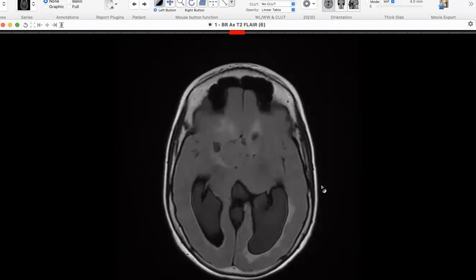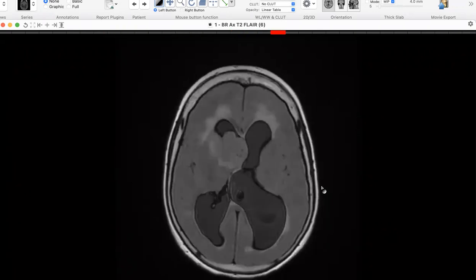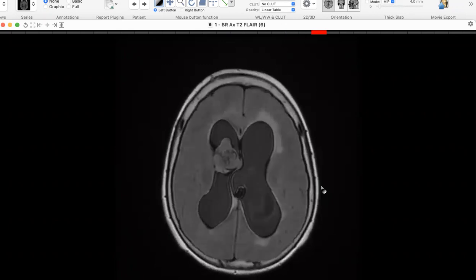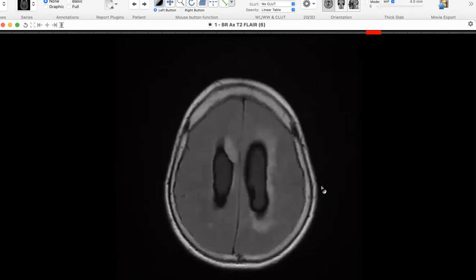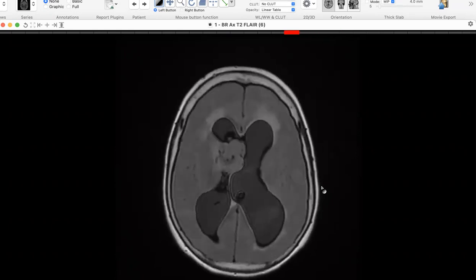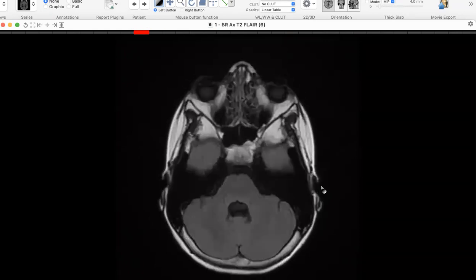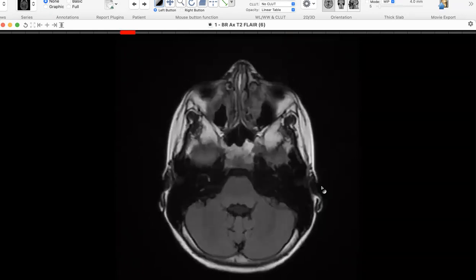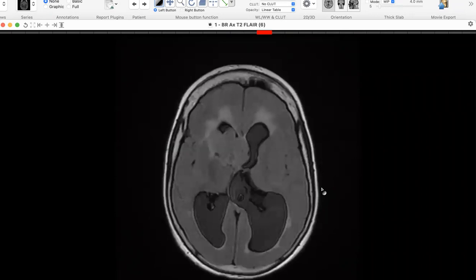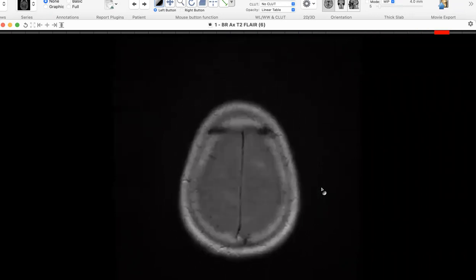Can SEGA be seen without tuberous sclerosis? Actually, it develops as an overgrowth of one of the tubers. So the stigmata of tuberous sclerosis should be there. Right. So what's your main differential in this case? The choroid plexus lesion and the ependymoma.